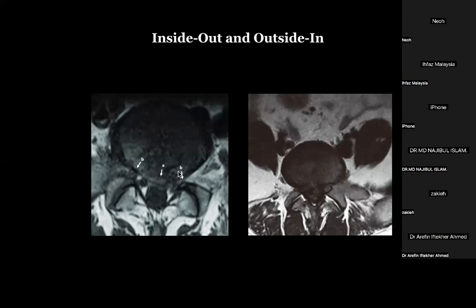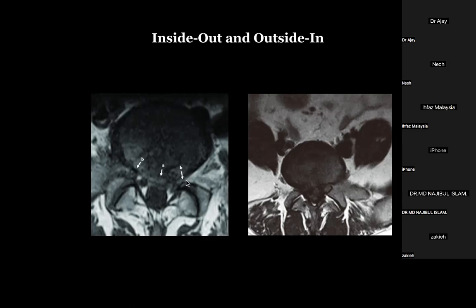Yes, sir. You mentioned in your first lecture that the calcified one is darker on MRI. Yes. And when we take it out, you will see a slightly yellowish-brownish colored fragment, slightly harder as compared to other disc material. In that case, yes, definitely you can go inside and start extracting it from there, from inside also. That is very much possible.